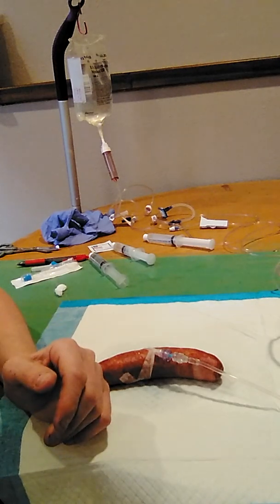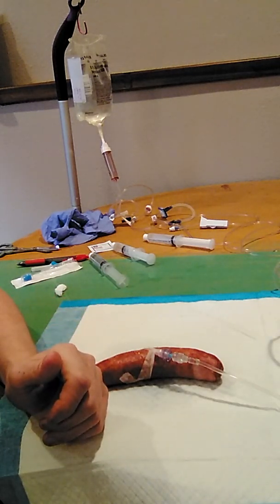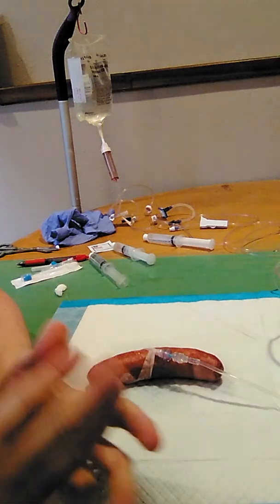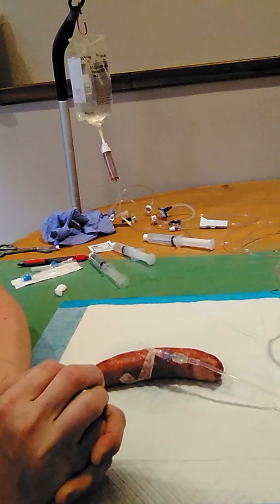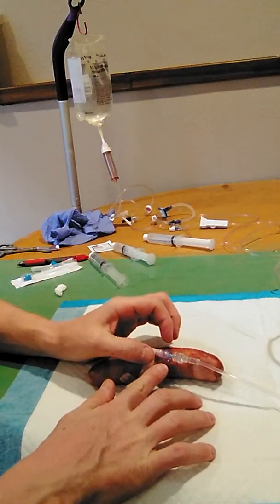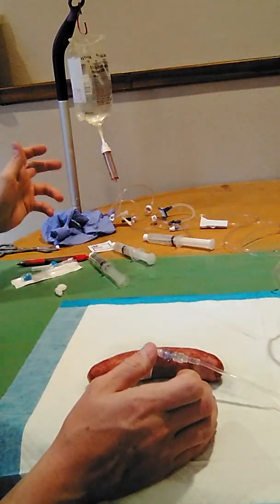Now that I see all of those are accurate, I would obtain a medication administration record and an order from the healthcare provider. So firstly, I'm going to check the standard things such as patient safety, privacy, body mechanics for myself and the patient, ensuring that they're in a safe position. And I'm going to access the IV site and determine that patency is present on this IV site.